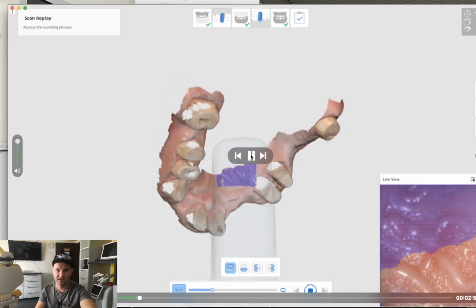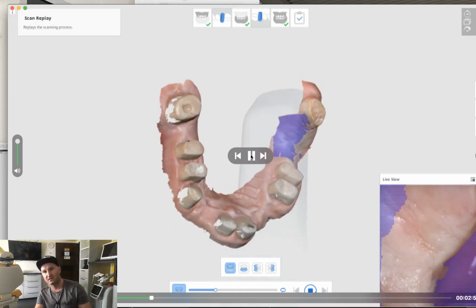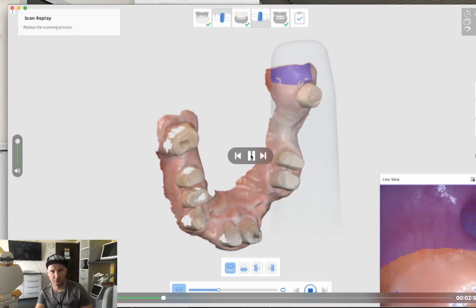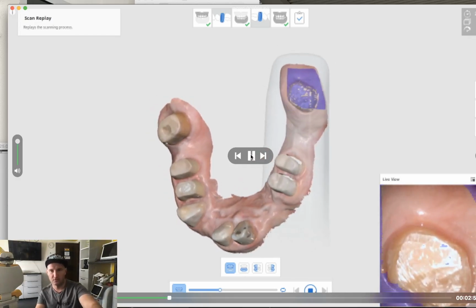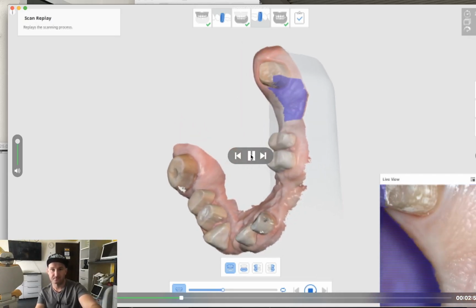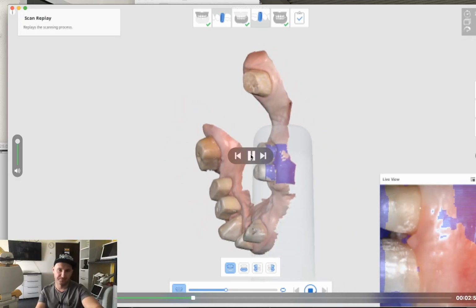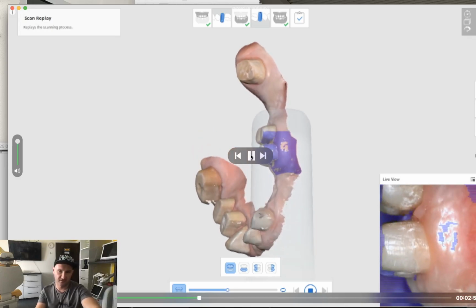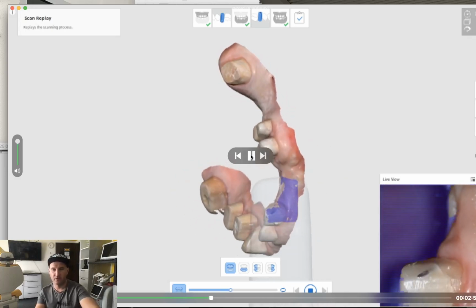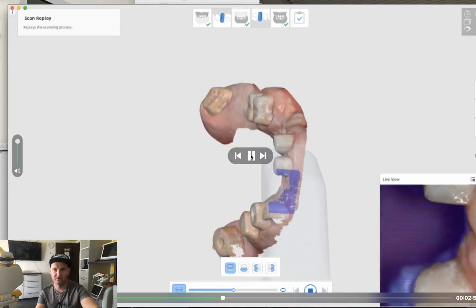the occlusal surfaces, and in this case, on the upper arc scanning, we go on the palatal surfaces, and when we are done with that, then we go to the labial surfaces of the teeth, and we just keep on scanning until we scan those three surfaces till the end. And then when we are done with this, we go with the details. So after that we are registering the details.